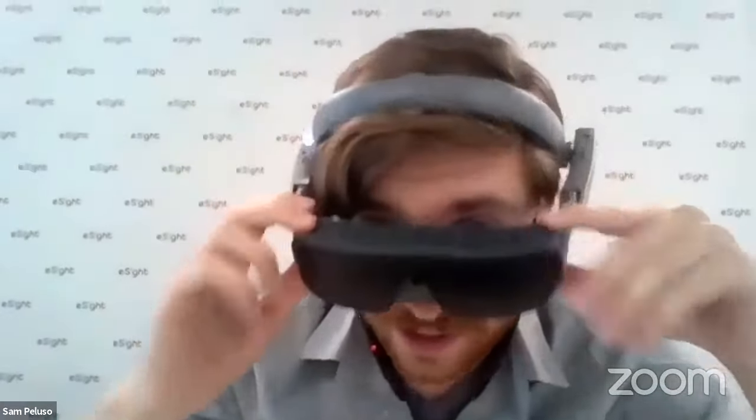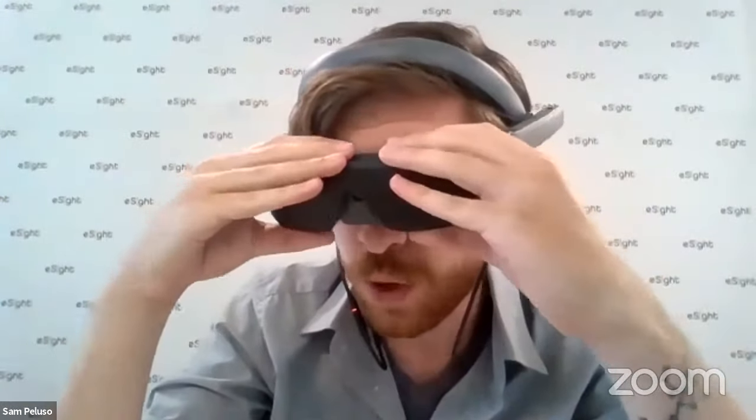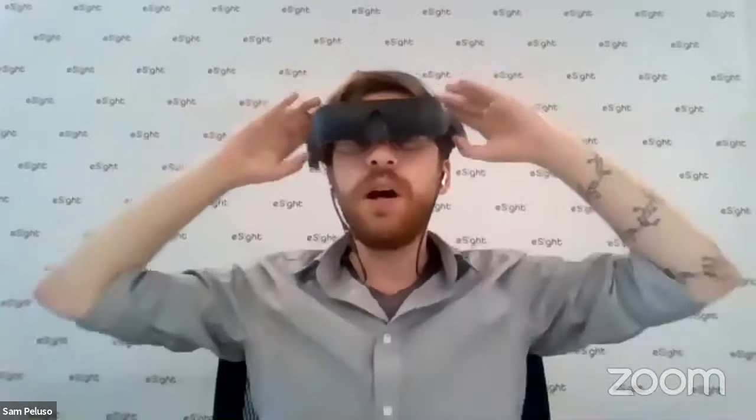The nice part about this is, you can see, I don't know how close I can get to the screen here, but this venting actually isn't touching. The visor itself is the part that gets warm. The battery doesn't heat up. The visor is the part that gets warm. Okay. And it's not touching my face anywhere. Yeah, so there's still a bit of space for the device to vent that heat out into the air.